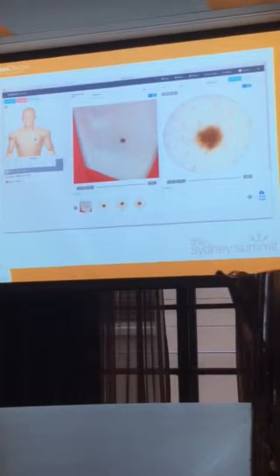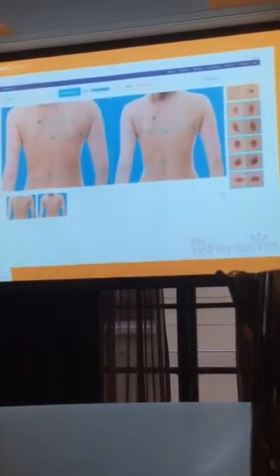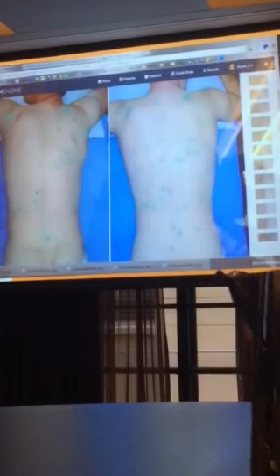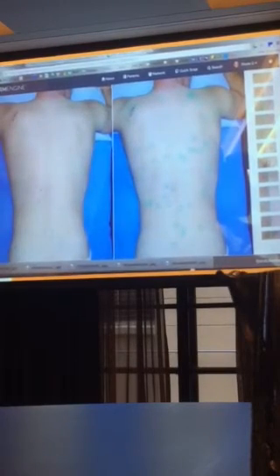This is a page I most often find myself on. That's the mole matching app, which is very useful. It can actually show some traction for if there's new users. Yes, that's right. And this is useful over time. Remember that I'm in a new clinic, and I haven't got that month and year upon year of patients coming back. But with time, as we've got examples which I've preloaded onto what we're going to use during lunchtime to demonstrate, we've got examples of patients who have come back where things have changed. Will it show us if it's changed? Will do, yeah.